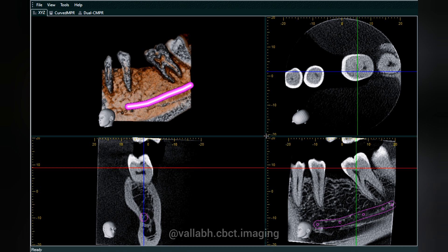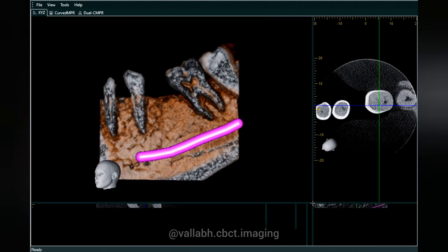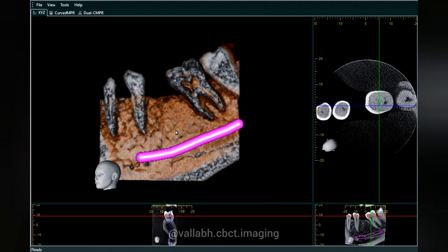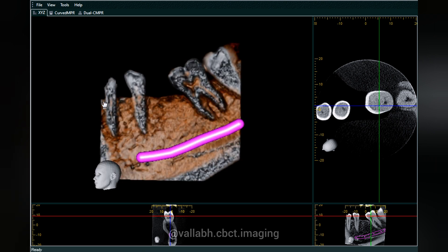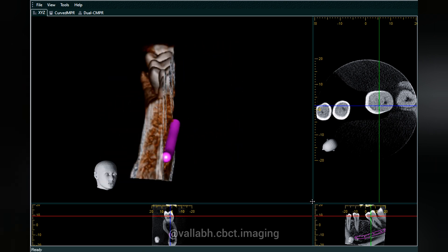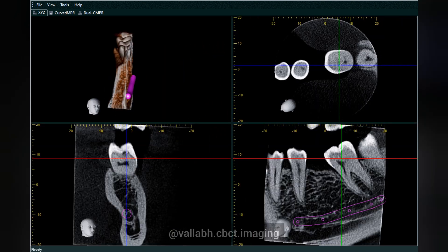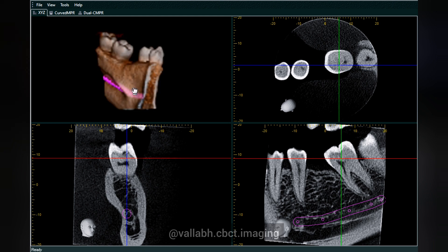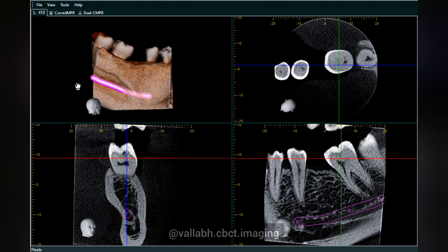The inferior alveolar nerve canal is one of the important anatomical landmarks, especially for implant planning cases. So this was basically about anatomical landmarks as seen in a 3D volume scan.